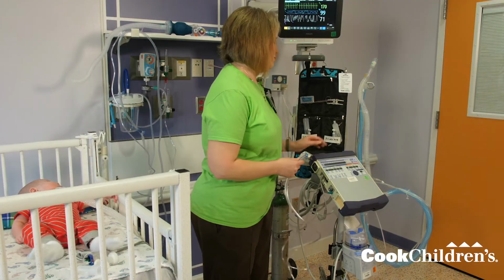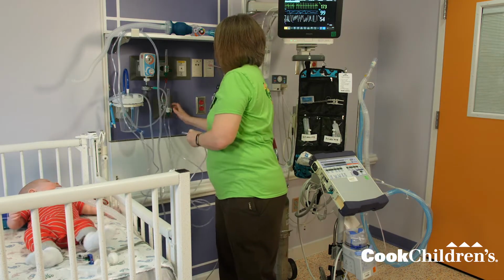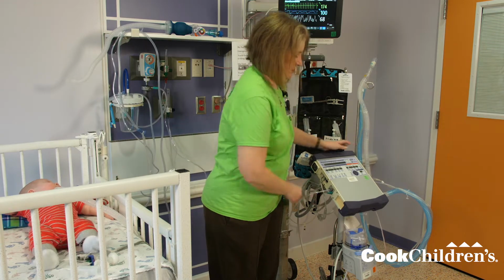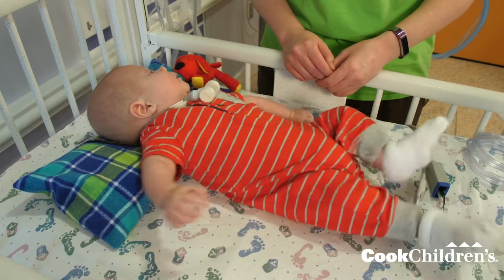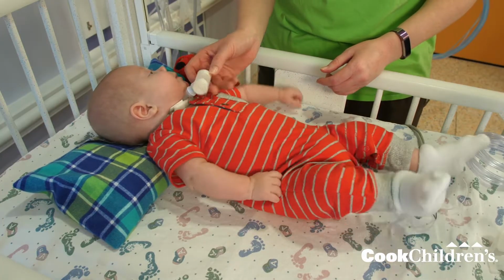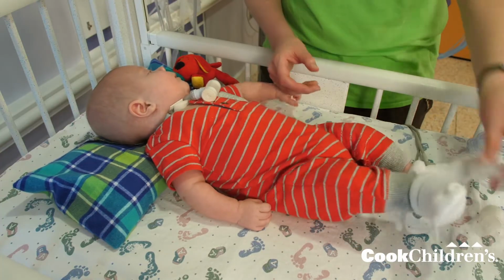If the child with a trach is on a ventilator, attach the oxygen tubing to the oxygen source and to the oxygen port on the left side of the ventilator. For children with a trach who are not on a ventilator, there are 3 different attachments used to give oxygen. These attachments are a heat-moisture exchanger with oxygen, also called an HME with oxygen, an O-ring, or a pressure line adapter.